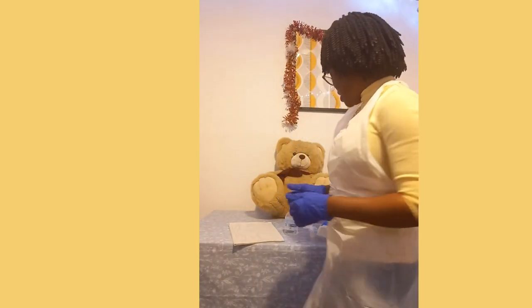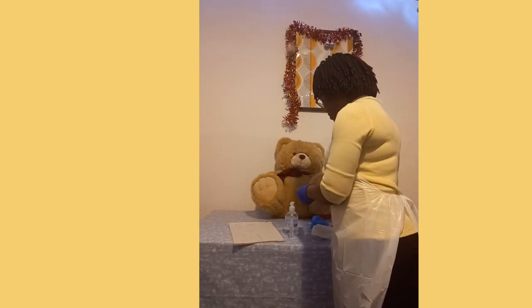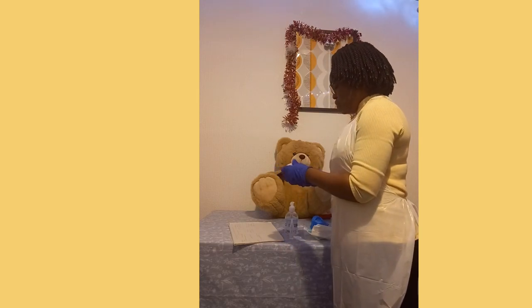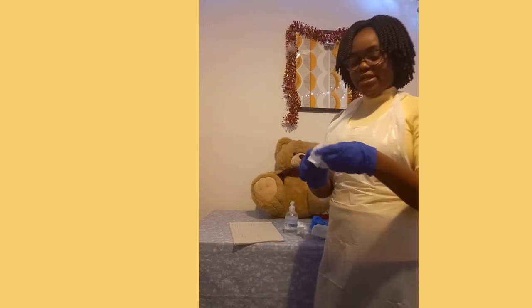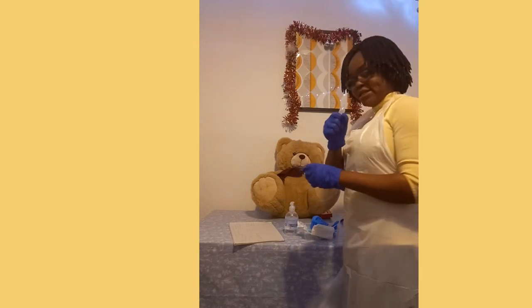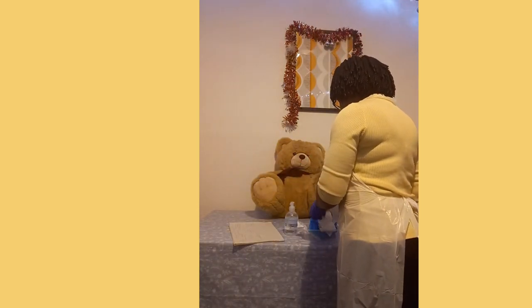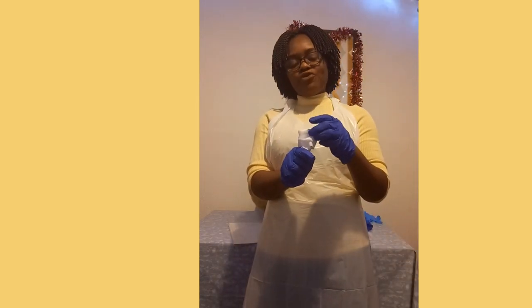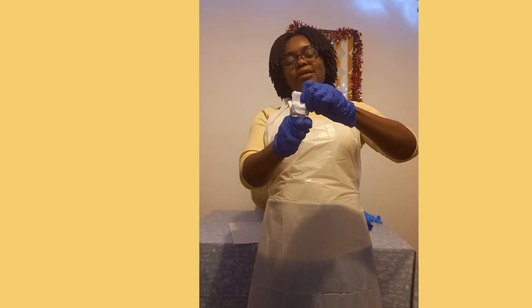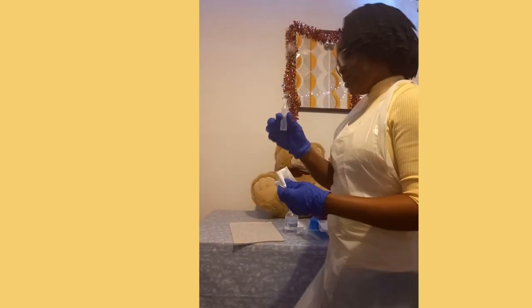Before I go to my patient's side, I'm going to prepare the medication. I have my hydroxocobalamin and I'm going to clean it with one of the alcohol wipes — cleaning the top part, the peak part, for 30 seconds, then allowing it to dry for 30 seconds. Assuming 30 seconds have passed — you verbalize it that way in OSCE. Then I'm going to use one of the gauze to break the injection away from me, so that if it splashes it will not splash on my body. I discard the broken parts inside the sharps box.